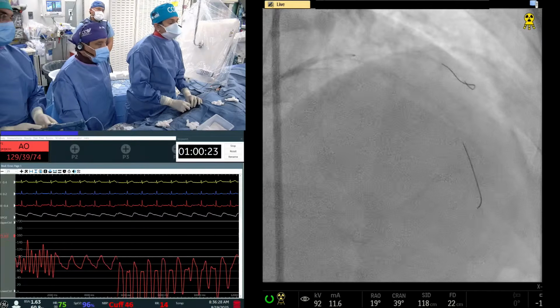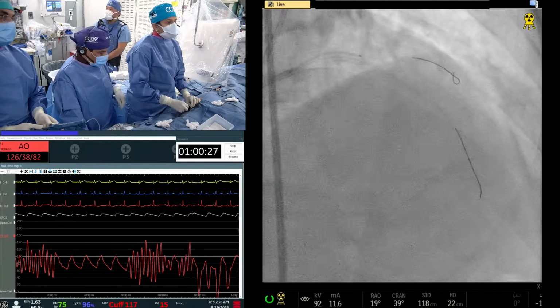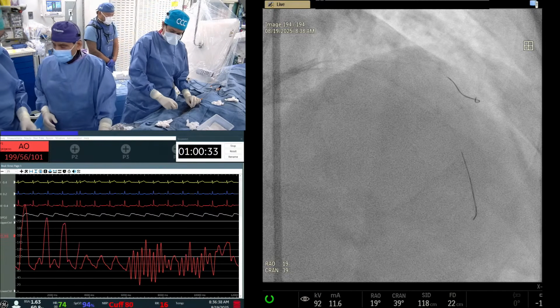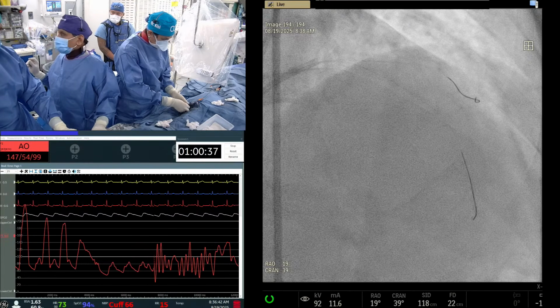No, 1 second. We may need a little more. Your cutting balloon. Get a 2.25 cutting balloon. No, but take it out. Not ready yet. 2.25 cutting balloon. So ostial still needs a little extra work. Right. And you'll, of course, stay away from that dissection. Yeah, just ostium will do it, yes.